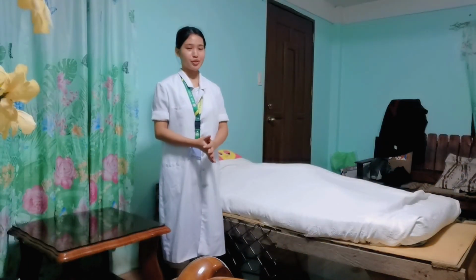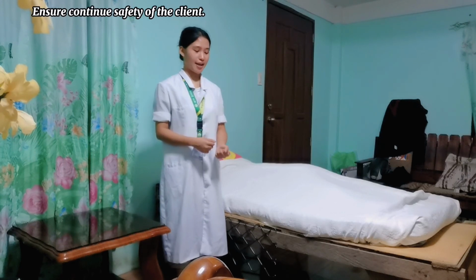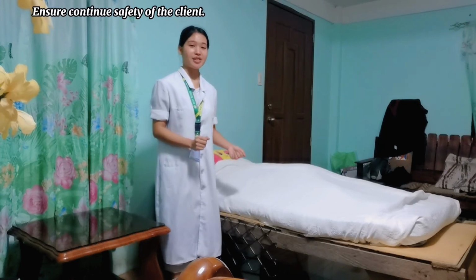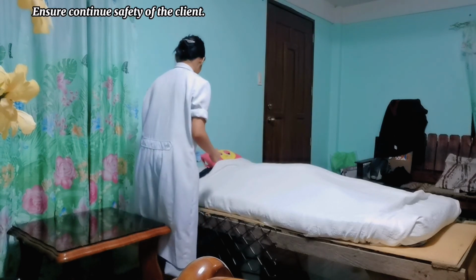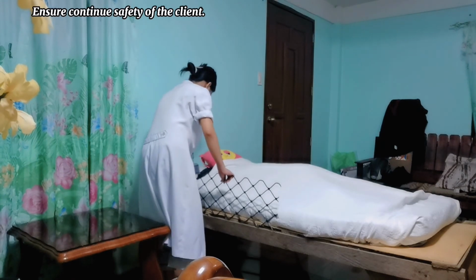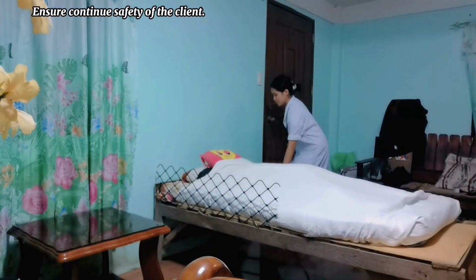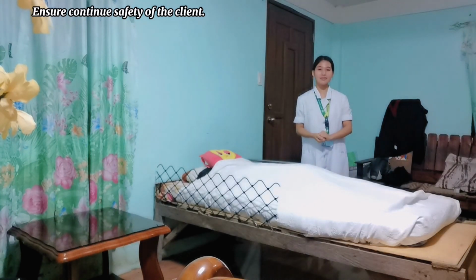After all the procedures that I have done, we must ensure the safety of the client by raising the side rails of the bed. And then after that, of course, we must perform hand hygiene.